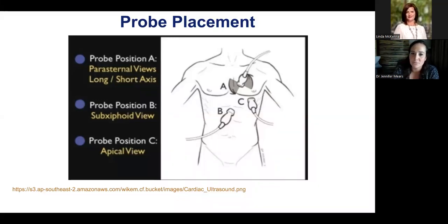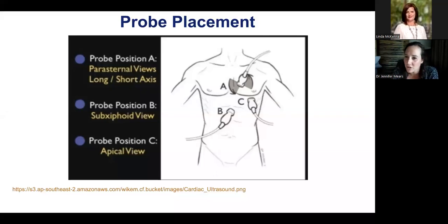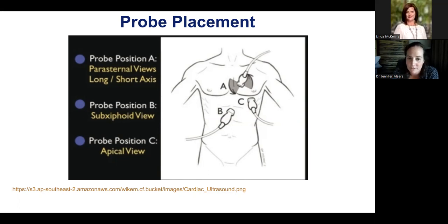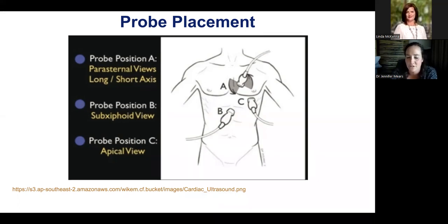Looking at probe placements: position A is between the third and fourth intercostal space, just to the left of the sternum — this gives both the parasternal long and parasternal short views. Probe B is the subxiphoid or subcostal four view, literally just below the xiphoid process where you flatten and look up under the ribs. Probe C is the apical view — commonly the apical four, though there are also apical two, three, and five views depending on what segments of the aortic tree you want to evaluate.